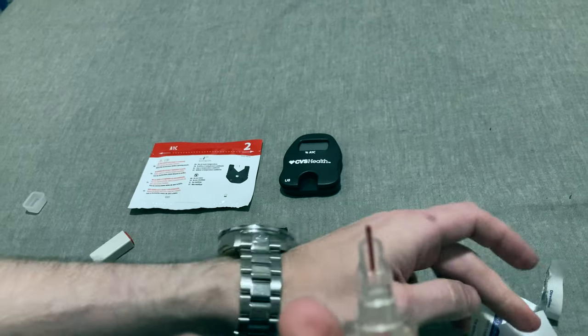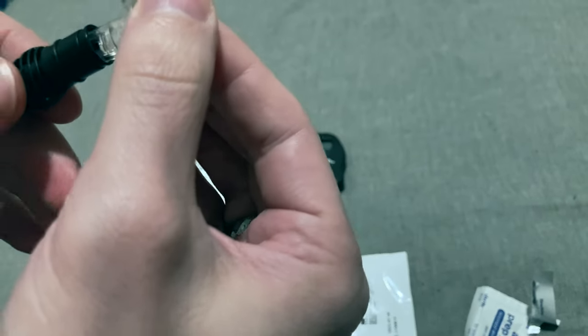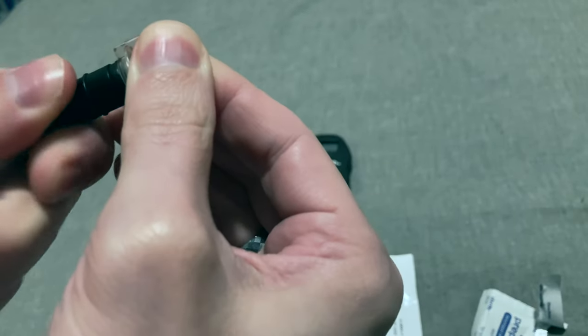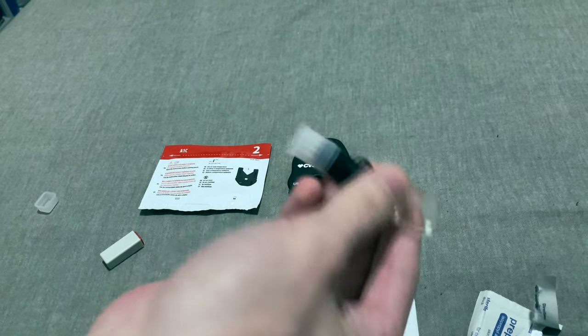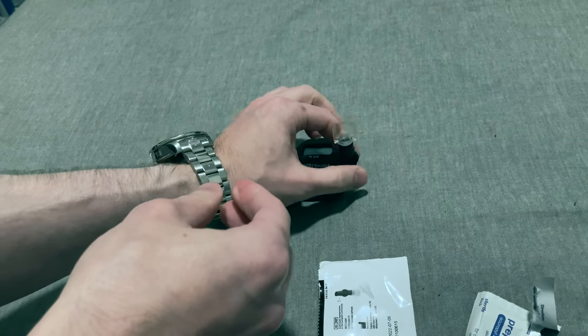Okay, now I'm going to wipe my finger off on that isopropyl alcohol tab. Now, what you do here is you're going to push all the way down like this. They put finger attachments here so you can push and twist. And now you're going to shake this. 1, 2, 3, 4, 5. And we're just going to set that down.